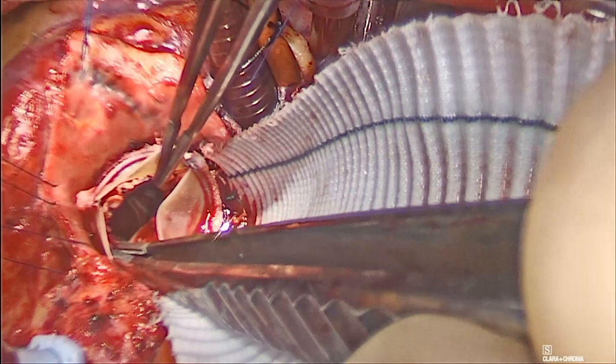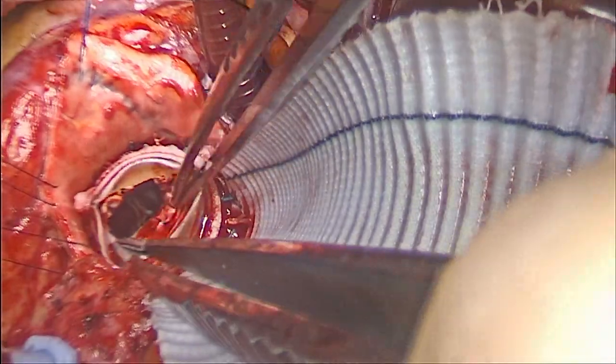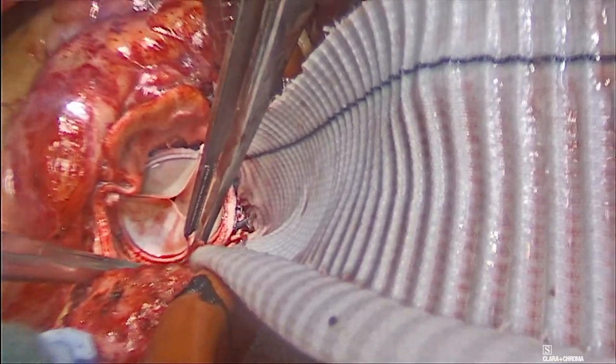The valve was then inspected, and the enlargement area is shown clearly with the arrow. The right and left coronary arteries were confirmed to be patent.